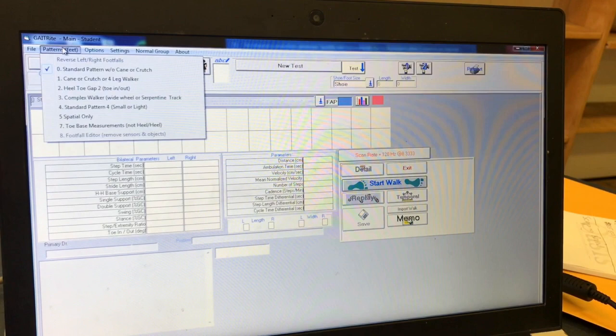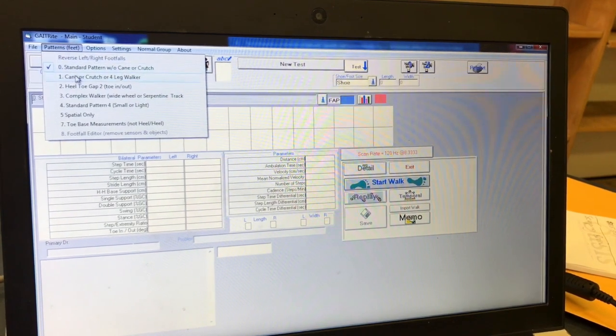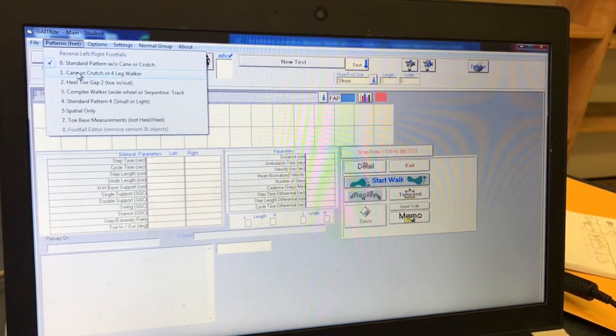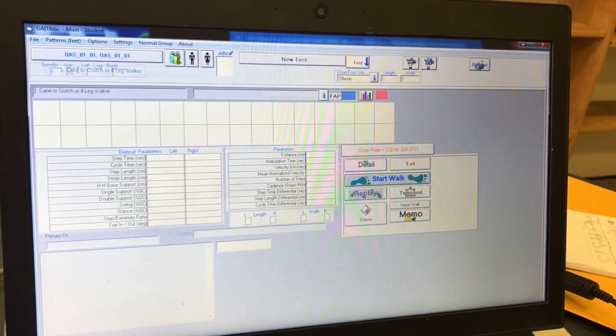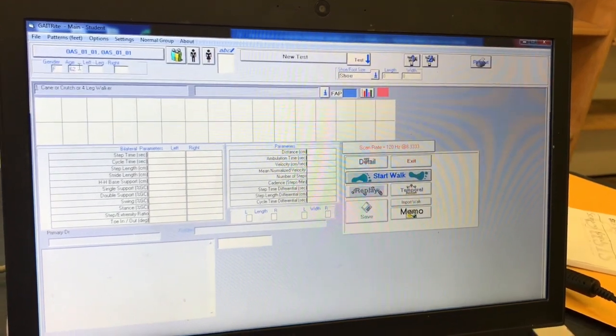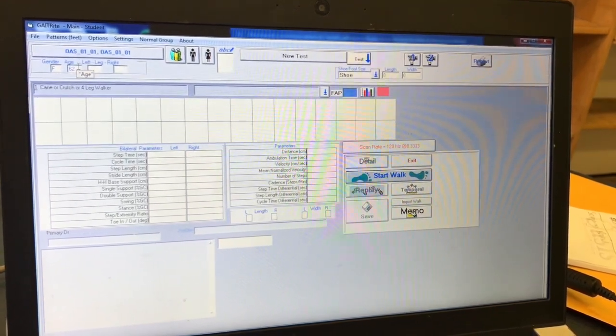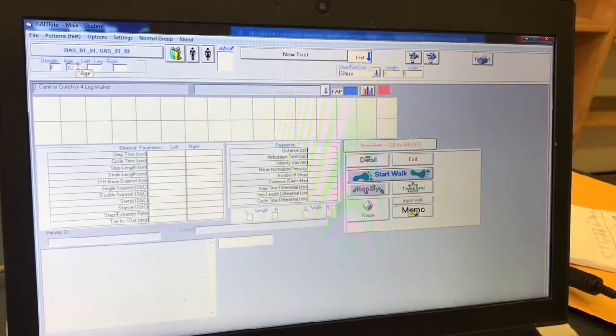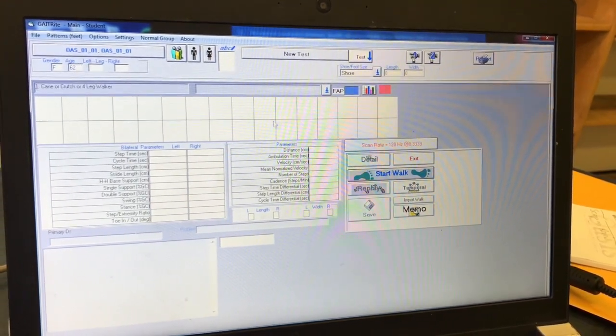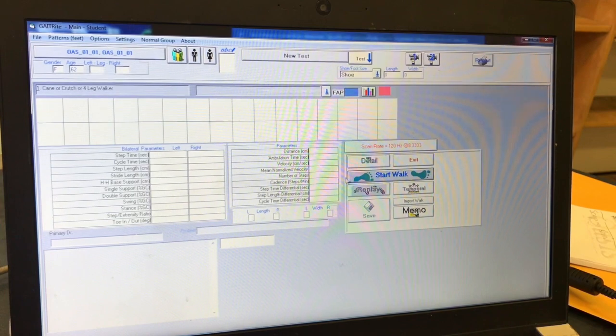For example, if the participant is using a cane, click on one, cane or crutch, or four-leg walker. If the participant is using a walker, you will want to click three, complex walker.